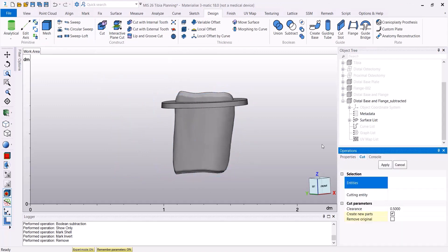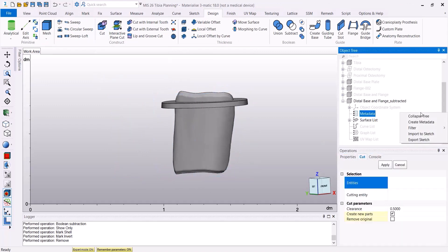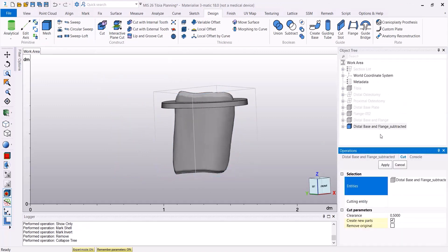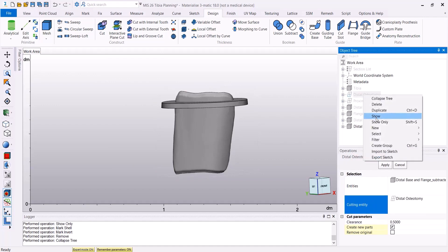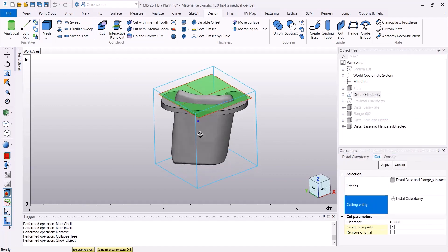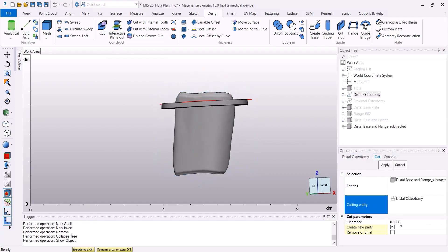Then I'm going to use the Cut tool to cut the upper part of the base, using the distal osteotomy as my cutting entity.